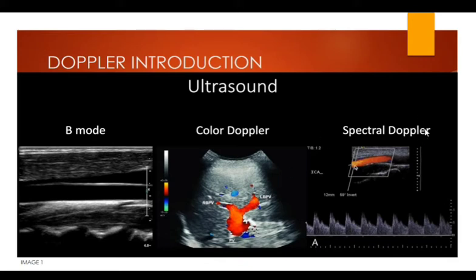When you look at spectral Doppler, which is the one over here on the right that I'm circling with the mouse, it has basically B mode running. Then it has a color Doppler, which we often use to know where to put our little gate. And then we have this little box, if you can see this little box here. And then we have a tiny little sample that we tell the machine, I'm only interested in this area.